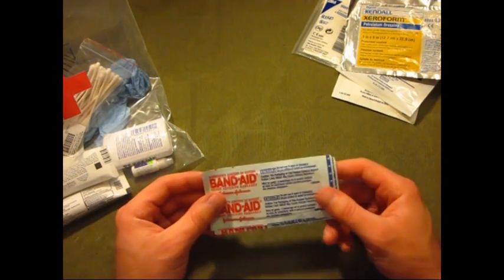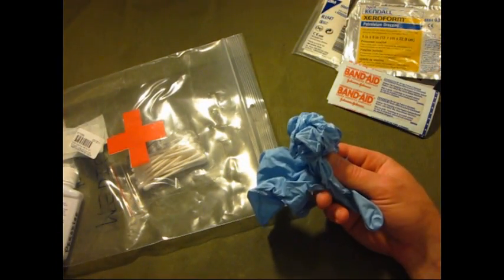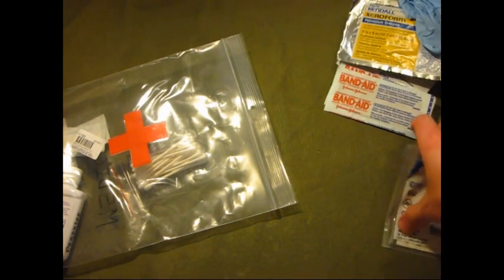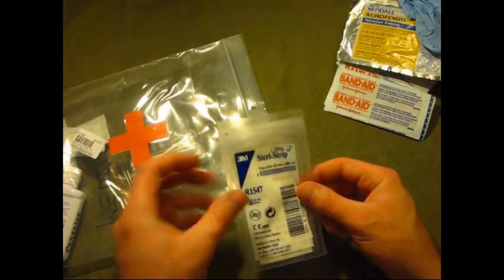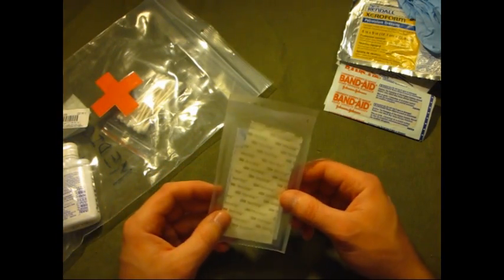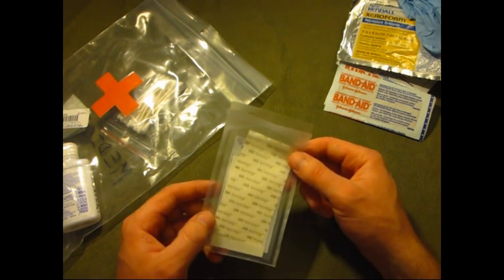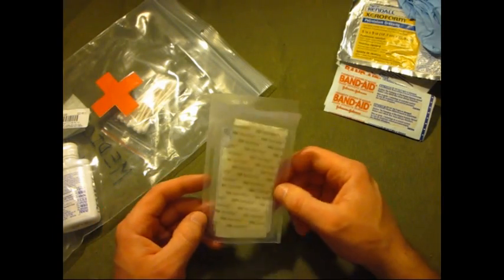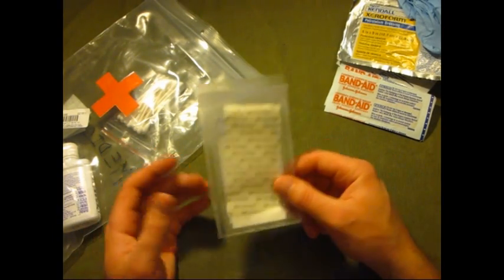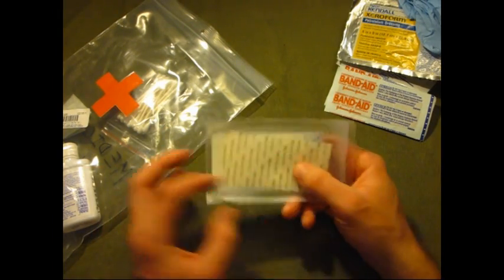Here's some big band-aids — the bigger variety. I've got some gloves in case you have to work on someone and don't want to spread blood everywhere. Here's some steri-strips — in case you have a nice cut and need to keep it together until you get back to get stitched up. I don't carry a suture kit, so I carry these steri-strips instead.